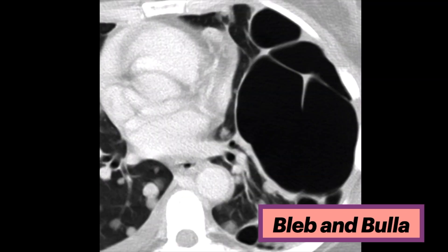This axial chest CT of a patient with benign metastasizing leiomyoma and left upper lobe giant bullous disease shows a large left apical air-filled space with internal septations. Holy moly!